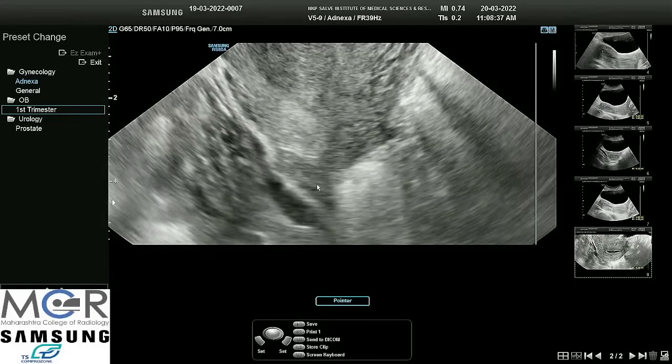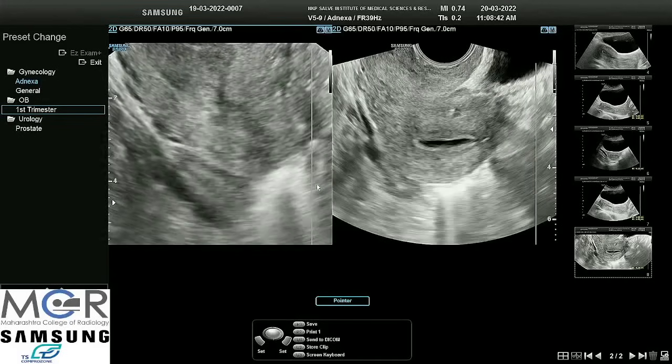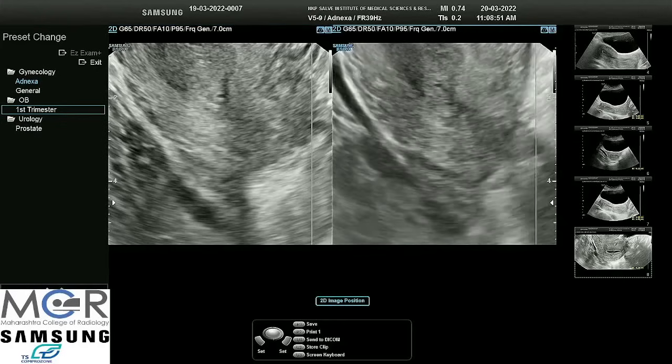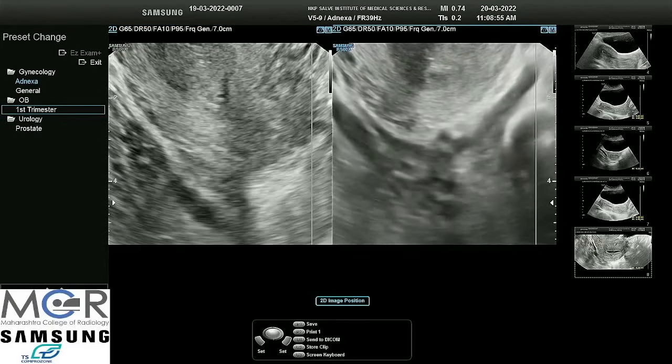Press the dual screen. Now we will freeze this image and take the second screen. I will turn my hand by 90 degrees to get another axis of the ovary.